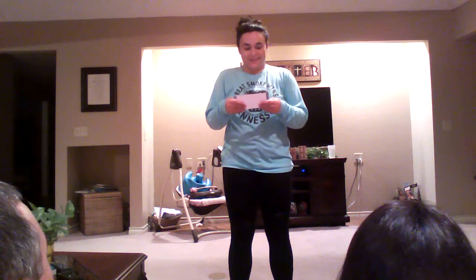This is my demonstration speech over how to start an IV, and this is a very appropriate topic since both of you work in the hospital setting. So the first thing you're going to want to do when you start an IV is hand hygiene, because you don't want to bring any infections in from another patient's room or from anything you touched in the hallway that happened to be transferred by another nurse or doctor.